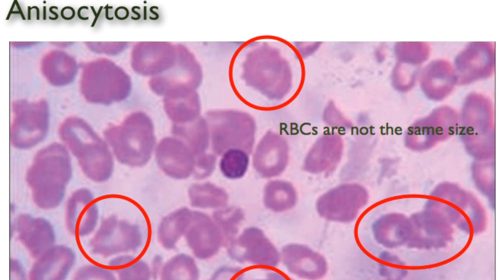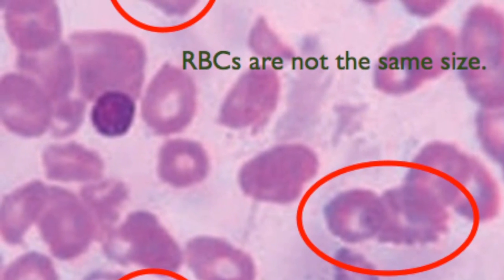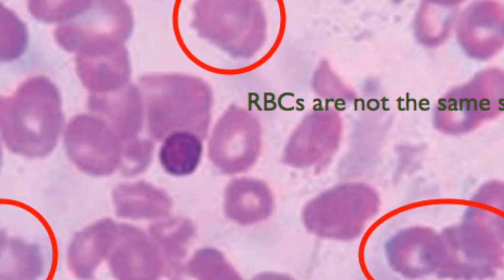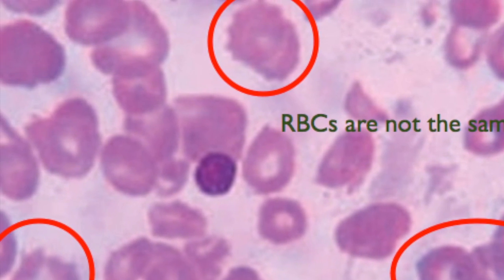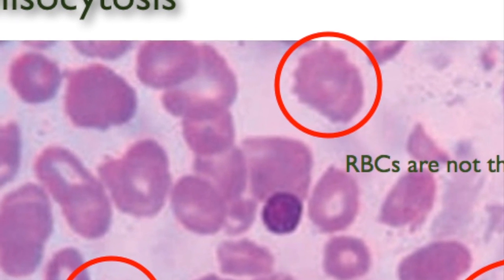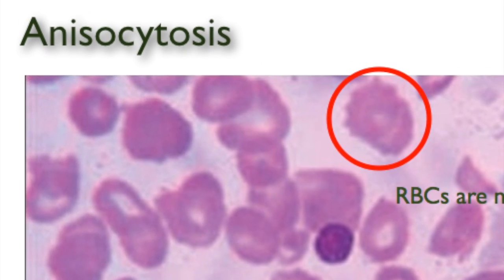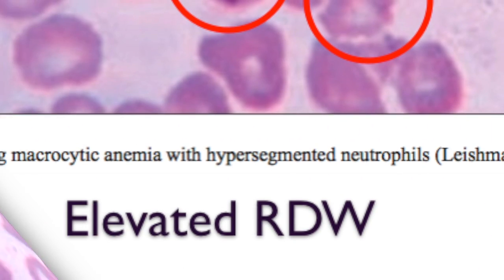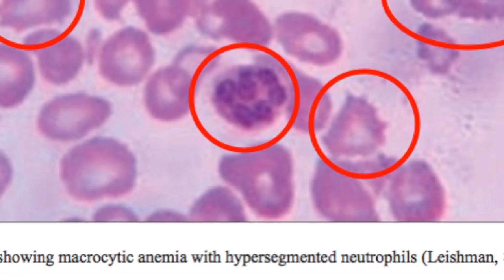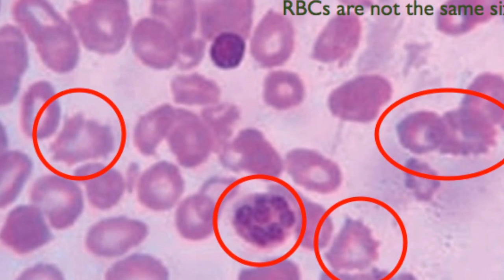Anisocytosis is a medical term meaning that a patient's red blood cells are of unequal size. This is commonly found in anemia and other blood conditions. False diagnostic flagging may be triggered by an elevated white blood cell count, agglutinated red blood cells, red blood cell fragments, giant platelets, or platelet clumps. Elevated RDW is a measurement of anisocytosis. Anisocytosis is identified by RDW and is classified according to the size of the red blood cells measured by MCV.